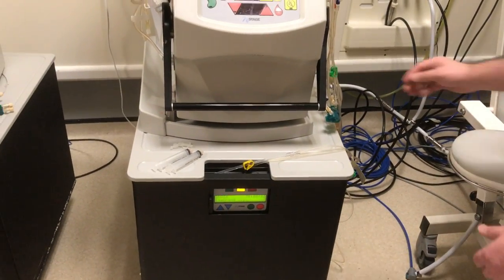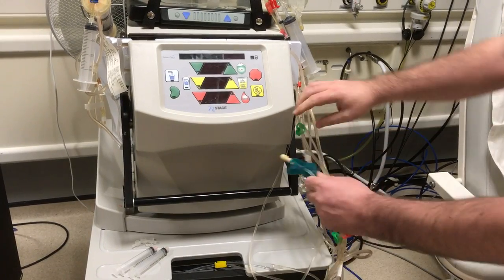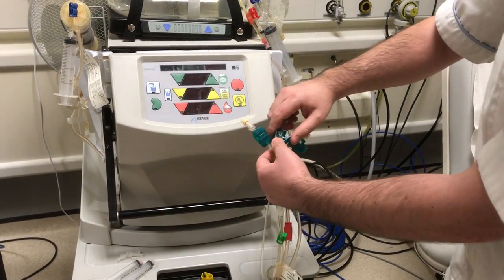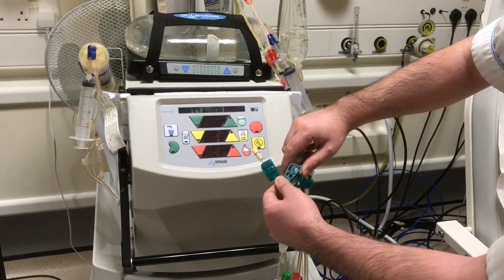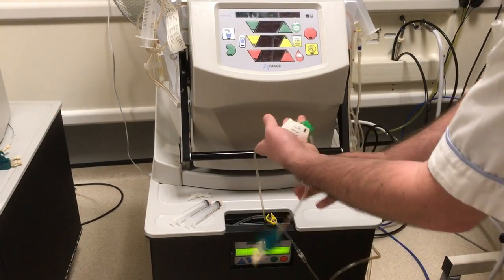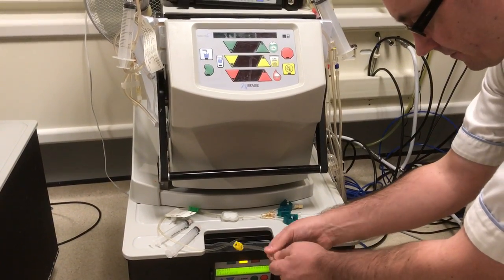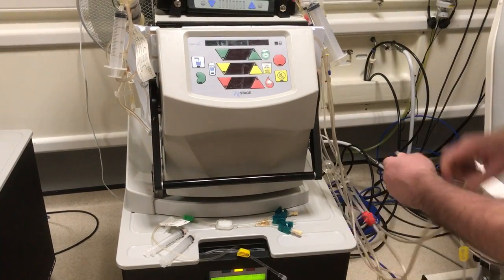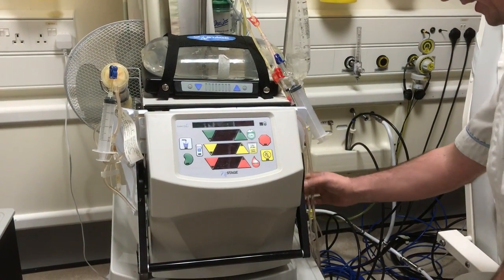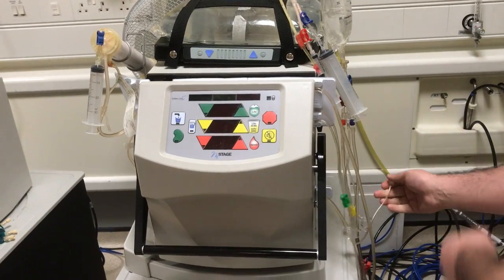We can now disconnect the machines from each other. The first thing to look for is your green line — we're going to clamp it at the top, at the bottom, and the middle clamp. This is a non-return clamp, so once you've clamped this you can't open it. We clamp that and disconnect that line. If we need it for the next session we leave it, but we don't. We then take off our yellow line and disconnect that — it goes back up to the saline bag onto the yellow connector. Finally, we take our access pressure pod off and disconnect that.